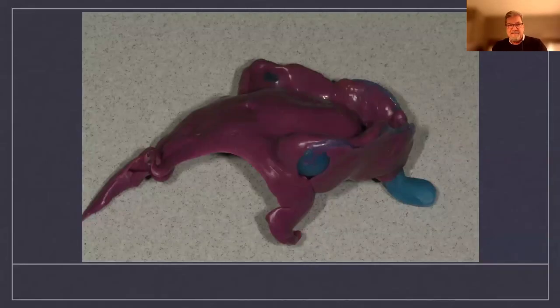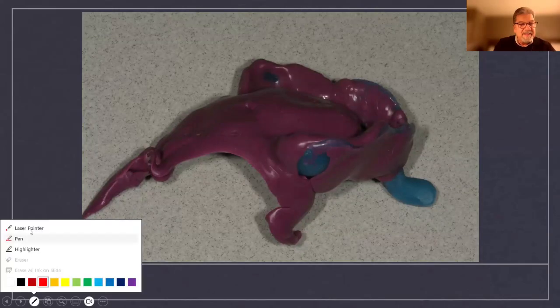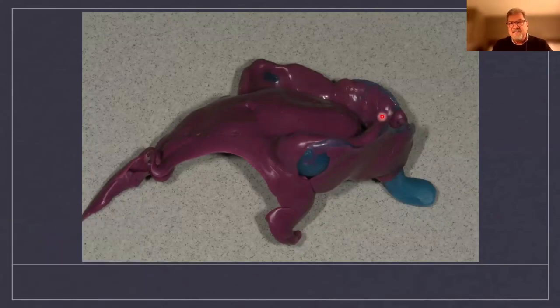How about this impression? This poor patient, right? They were probably sitting back in the operatory chair, and then all this material went down the patient's throat. Probably gagging, and you could see it wasn't even border molded correctly. Let me pull up my marking pen here, do my laser point. So this area here, you can see the custom tray, so it was never border molded. Possibly the patient was sitting back in the chair.